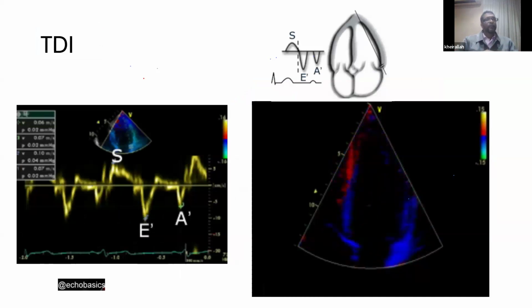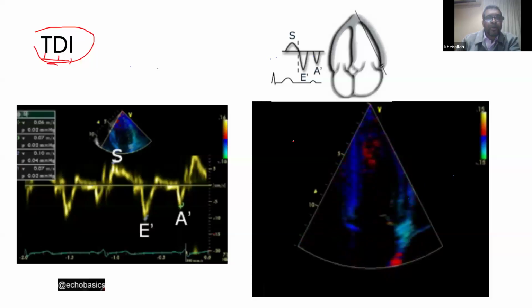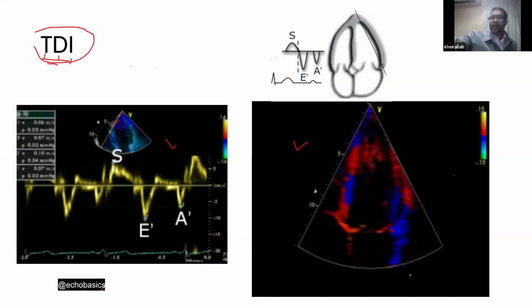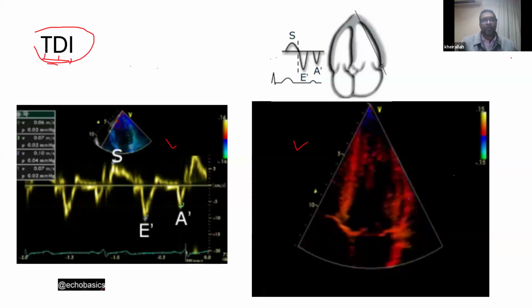So we have another concept, which is TDI, and TDI stands for tissue Doppler imaging. So when you see things like that, this is TDI, okay? Because it's based on color Doppler. So it uses two, color Doppler and PW. So what you have to do is in the machine itself, there is TDI. You press on TDI and you put your cursor where you wanna get the TDI from. And then you click on PW after you specify a point. So PW is gonna specify the point.